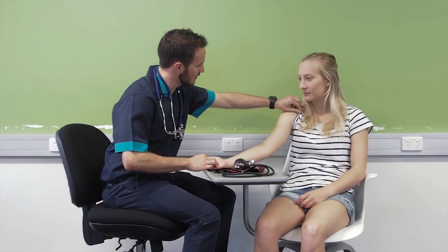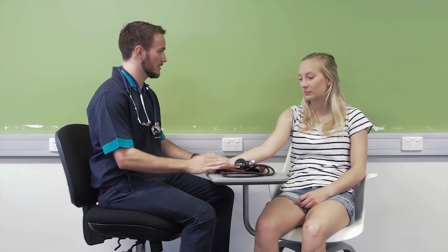Now before I start, have you got any questions Nicole? Is it going to hurt? Look, this is going to become tight on your arm, but it shouldn't be too painful. If it is, let me know. It is important to ask the patient not to speak during the procedure, as studies have shown that conversation has altered readings by up to 40%. Alright, during this procedure I'll ask you not to talk as this may alter the readings a little bit.